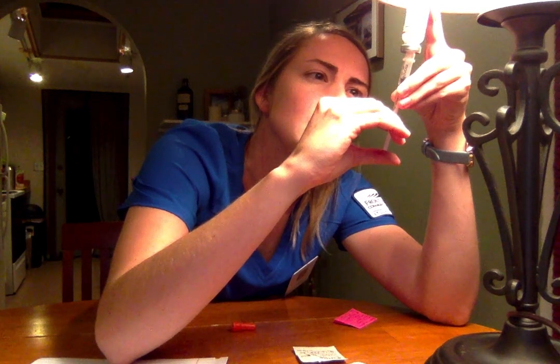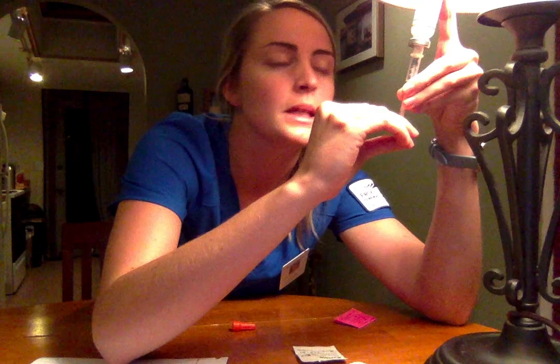Or push up. Okay, so the third mark down is there. I'm just going to do one more. Here. Okay, and I actually see a bubble here, so I'm going to do that again.